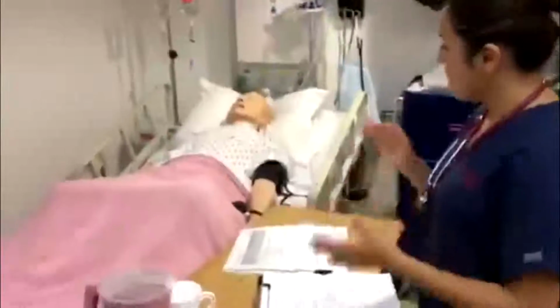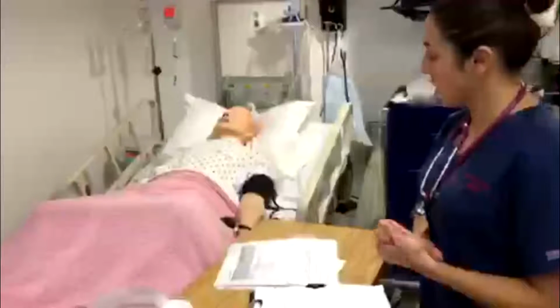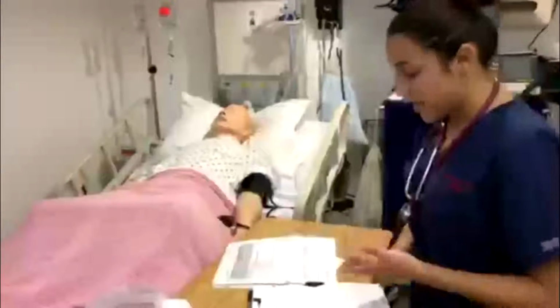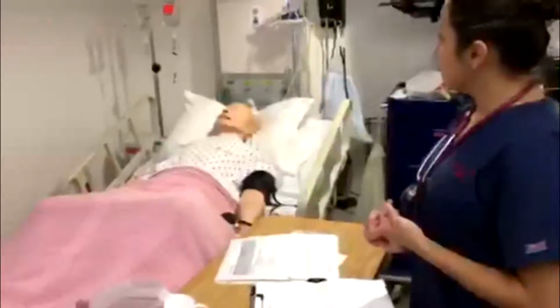So I want to make sure to document the IV site, which was on Mr. Sweetheart's right arm, how he tolerated it, the appearance of the site, it was intact without redness, inflammation, or swelling. The date, the time, my initials, and that is all.